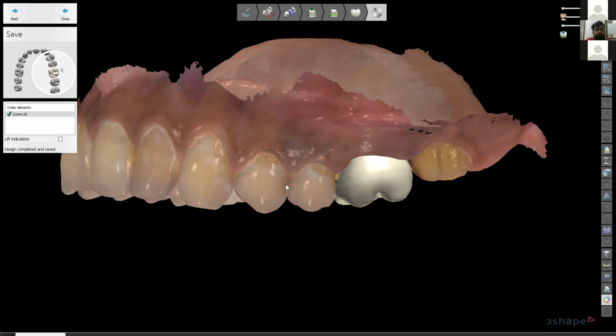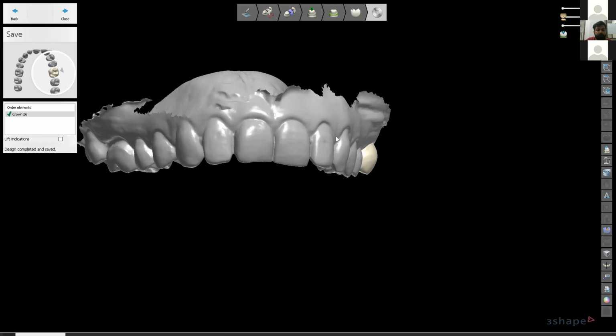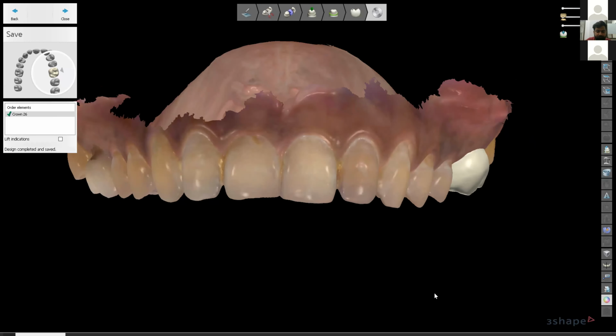The third thing is, if the dentist has a lab scanner but doesn't have designing software, then they'll be getting it this way. The dentist will take the shade physically, or they have a digital or a Vita shade guide handheld, directly in the patient's mouth. If they're sending the digital file to the lab, they have to send by email which shade color they want. But if you're sending 3Shape to 3Shape, you get a direct color, so on the order form itself you have an option to take it on the sheet.